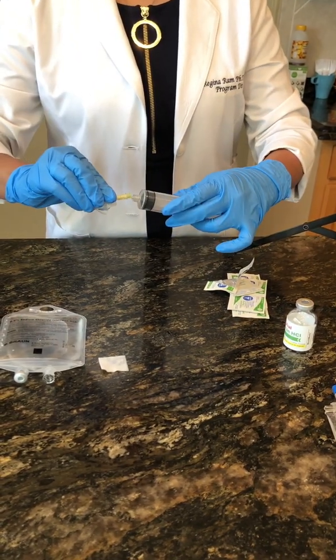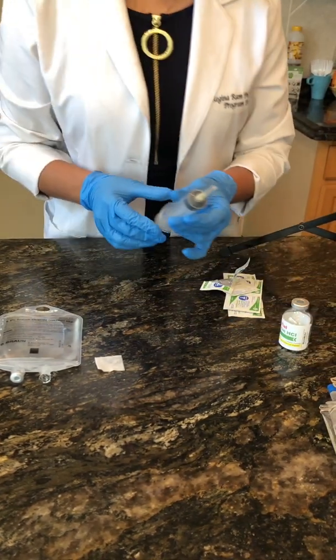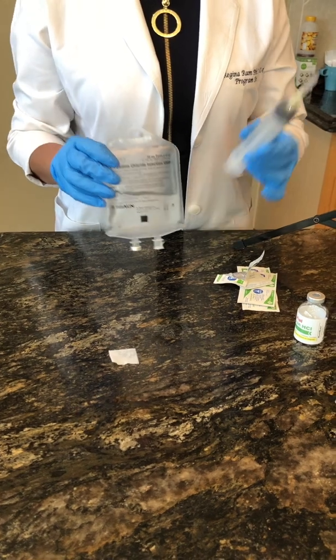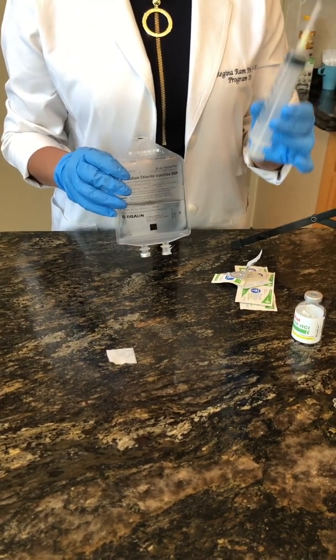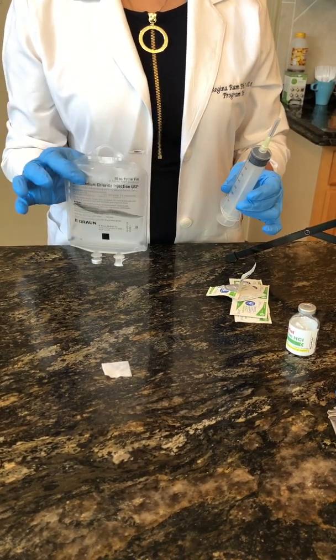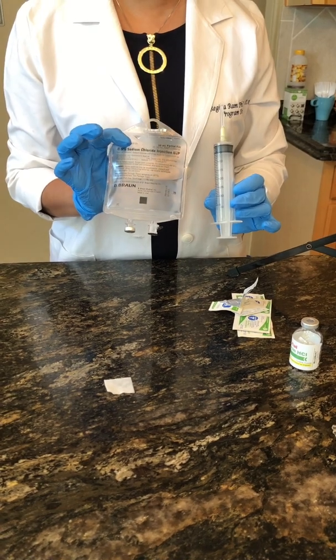This is the part where you guys can simulate. Because I'm removing this not from a vial but from an IV bag, I do not have to draw an equal or less amount of air — there's already air in this bag. So the first thing I'm going to do is withdraw 20 cc's of sodium chloride.